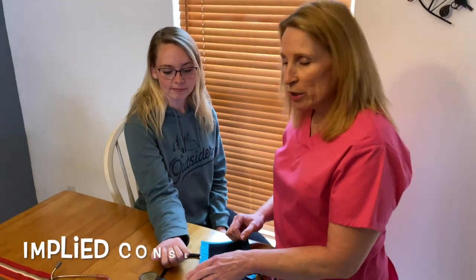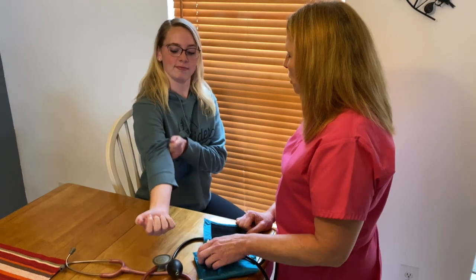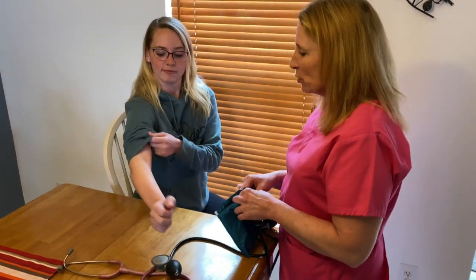Good morning, I'm Bernadette. I'll be your nurse today. Normally, I would be having my patient identify themselves, but today I'm going to be introducing my patient as Sarah, and she's been kind enough to volunteer to have a blood pressure performed on her during a tutorial. May I have your arm, Sarah? Yep. By her giving me her arm right now, it's called implied consent. Remember that for certification. Would you roll up your sleeve for me so I can perform an accurate blood pressure?